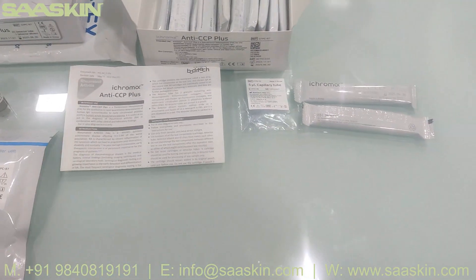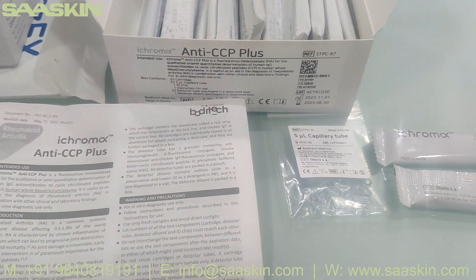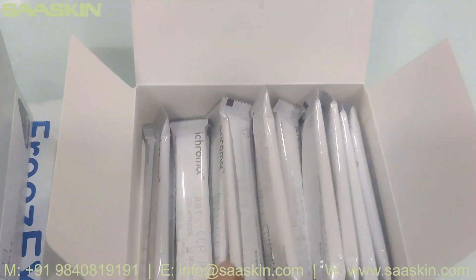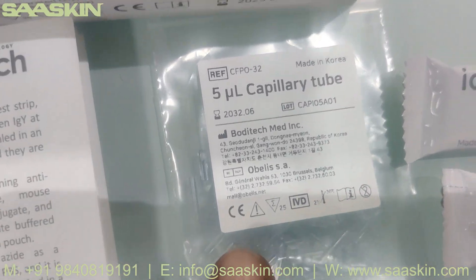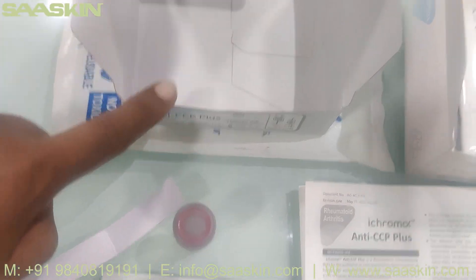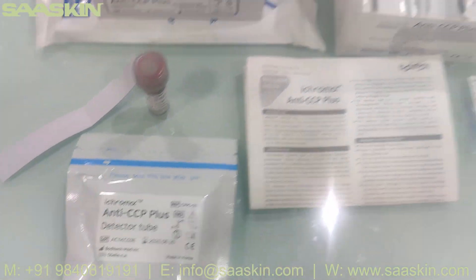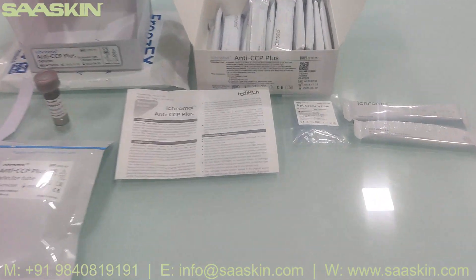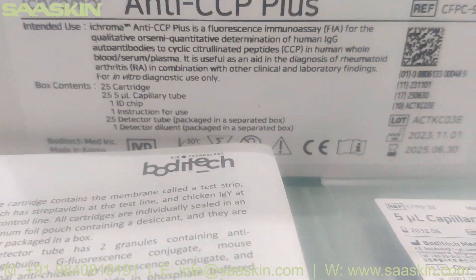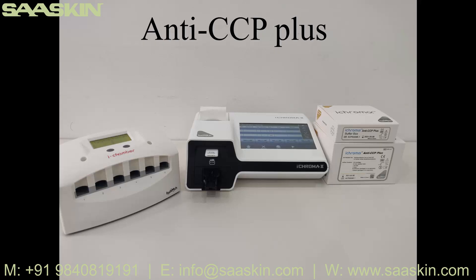To quickly summarize: today we've seen the unboxing of the i-Chroma Anti-CCP Plus. This is a 25-test kit pack. In the pack you get one IFU brochure, one ID chip, 25 cartridges, and 25 pieces of five-microliter capillary tubes. In the separate detector buffer pack you get the detector buffer liquid and 25 detector tubes. That is all the total test kit components. Thank you.